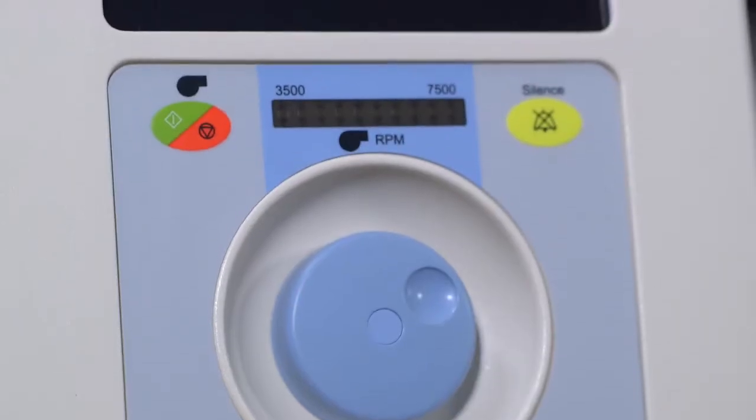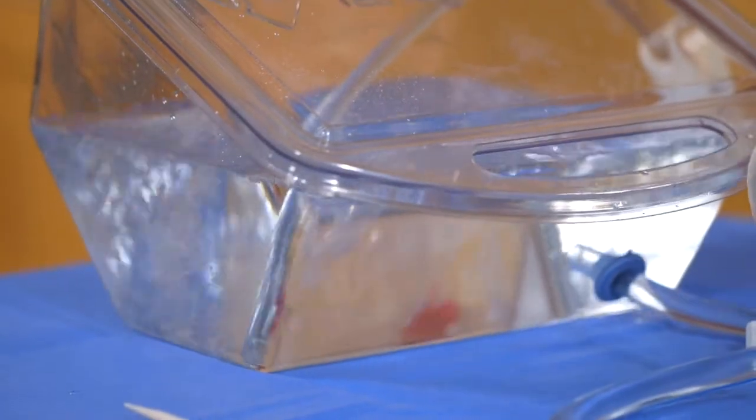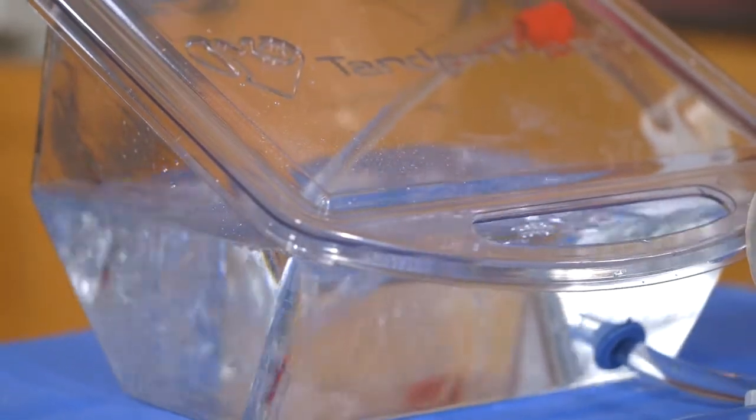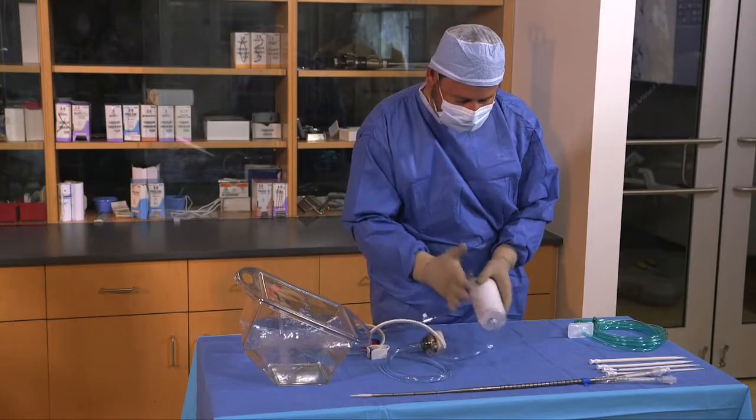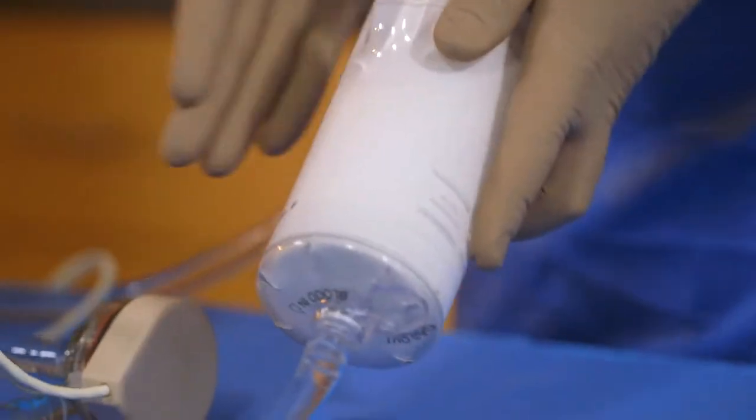The controller operator starts the pump while the sterile operator positions the oxygenator with the outflow port pointing upward and taps the oxygenator to facilitate air removal during the priming process.